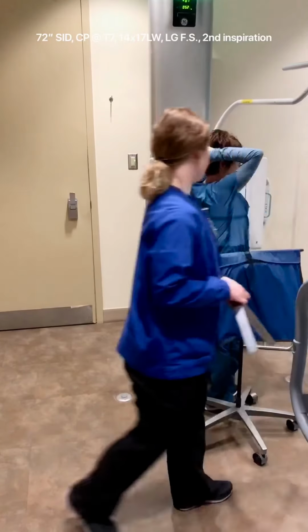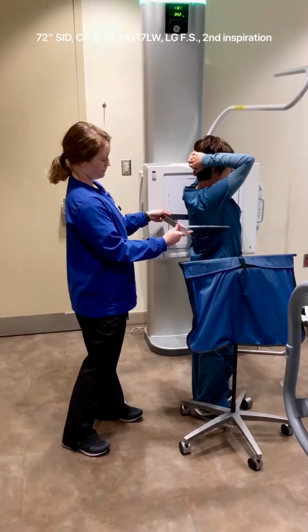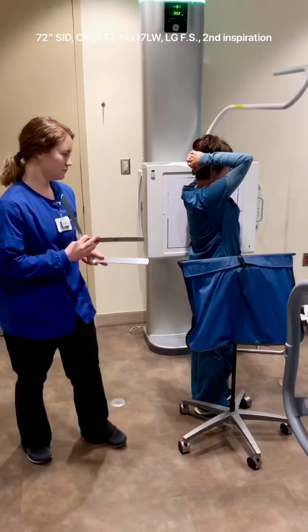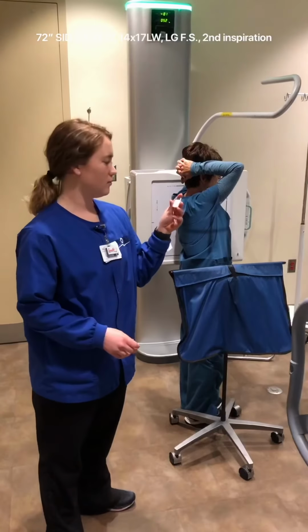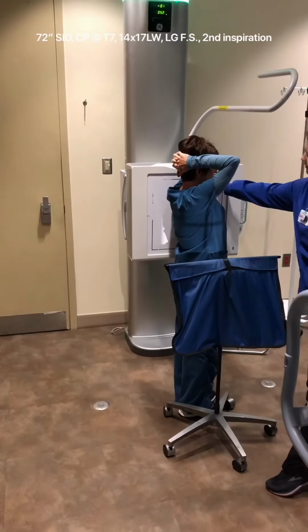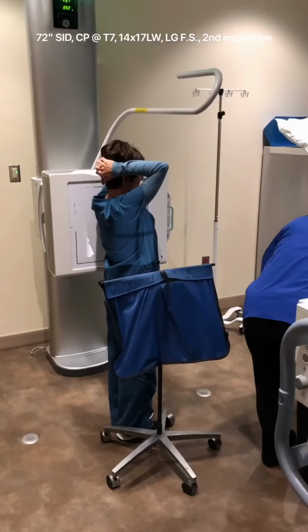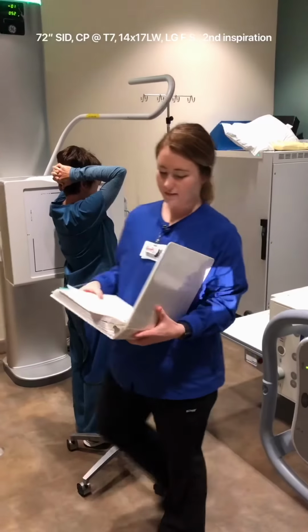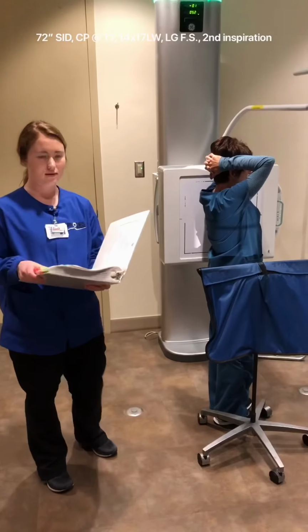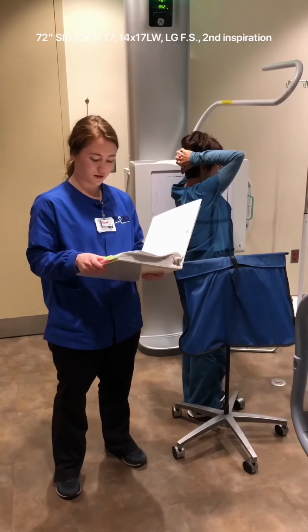Then you're going to measure the patient through her thorax where the beam enters. And she is 25 centimeters. For the lateral, you want to put the marker on the anterior portion of the patient up top. Still use the left marker. For the exposure factor, she measured 25 centimeters, so you're going to have it set at 91 kV, 16 mAs. Make sure it's still on the wall bucky, large focal spot.